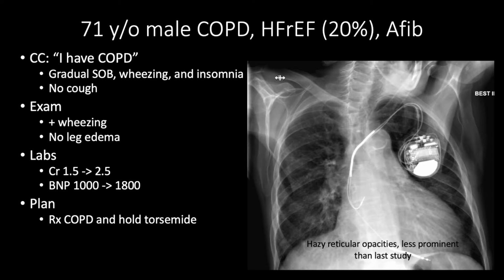The thought that this is all a COPD exacerbation, he's been over-diuresed and has a pre-renal AKI, but this is where volume status really comes into play. Could this be CHF and a cardiorenal AKI? Or is this a dry lung and a COPD exacerbation and a pre-renal acute kidney injury? What is this patient's volume status?